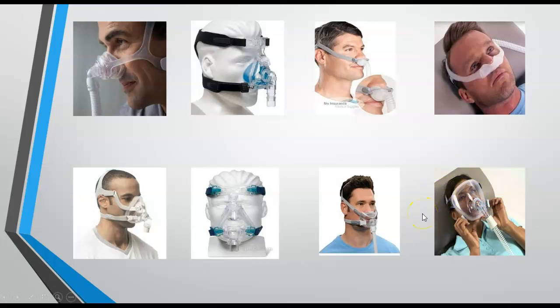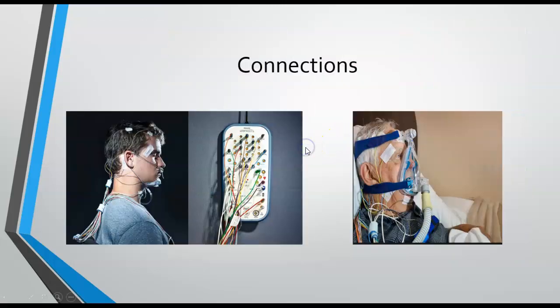Which mask to use during the titration study is basically patient convenience. Most of the time, what we see is that historically the treatment is called nasal CPAP titration, nasal CPAP treatment, and hence the better choice of mask is the nasal mask. But there is no harm in using any of these masks, based on the patient's convenience.